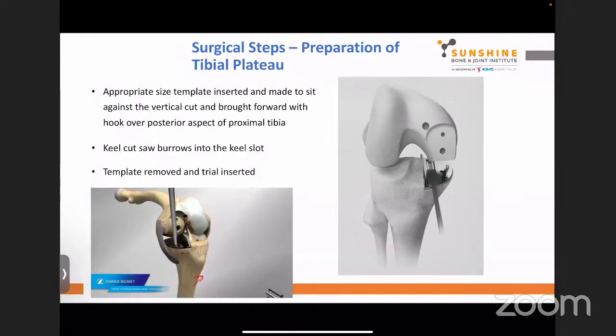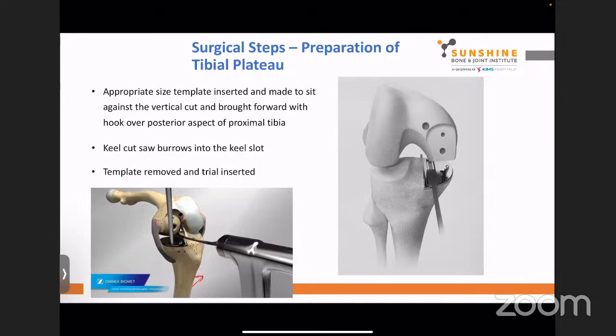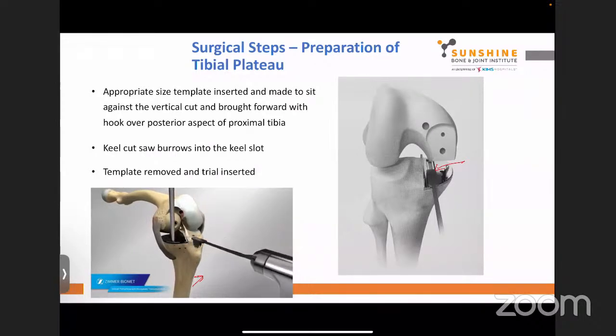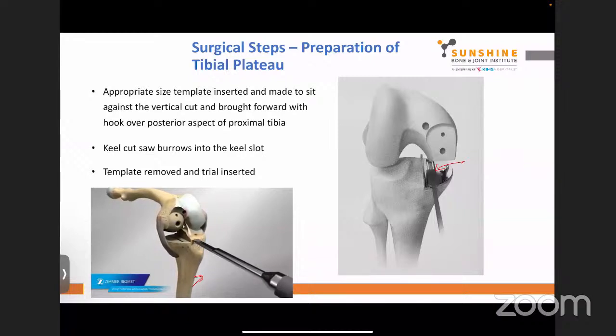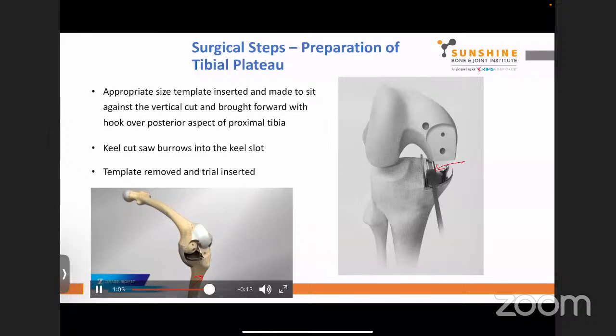And then you take something called a toothbrush saw, and it goes into the keel, creates your keel. Okay, you're able to see this, I hope, and you can see this in this picture as well. And once that is prepared, the whole construct is taken out. Okay, and now you have your keel prepared. You take out the remaining bone with this digger. And once that is done, you put in your trial implant. Your trial. You hammer it in with this punch.